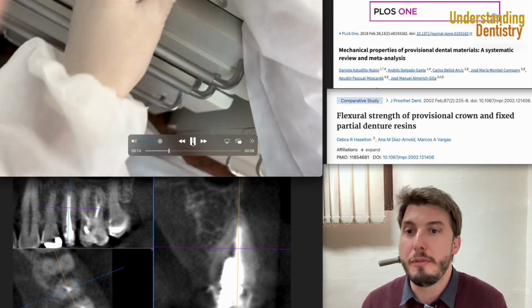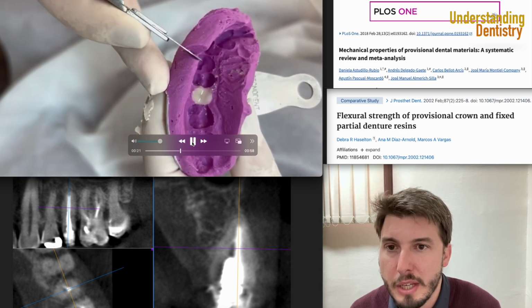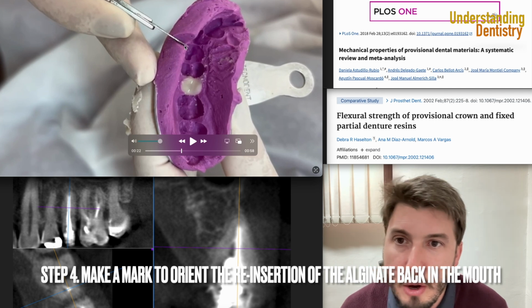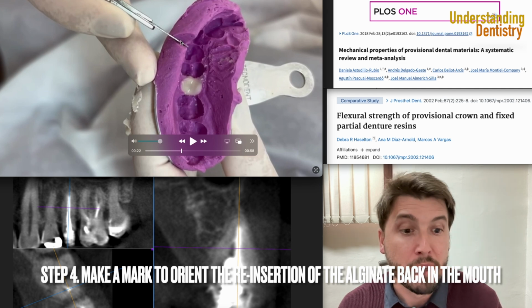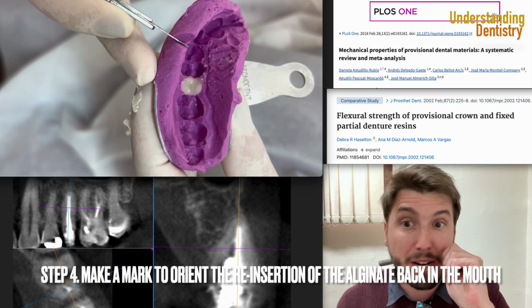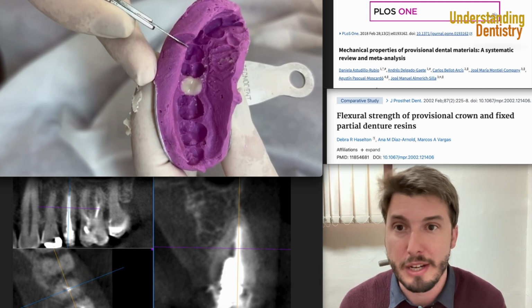All right, so now, of course, the preparation is done, and then we are putting resin on the tooth, okay? So very good. Now take a look at this. We are doing here a mark with the scalpel blades or any sharp instrument on the canine. Why are we doing this in front of the canine? For you to know the position to bring back to the mouth, okay? Because you are going to bring this back to the mouth after your preparation to make your temporary crown, okay? So you're going to adapt this crown that you just did on the preparation.